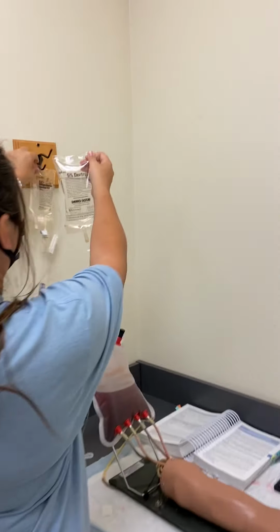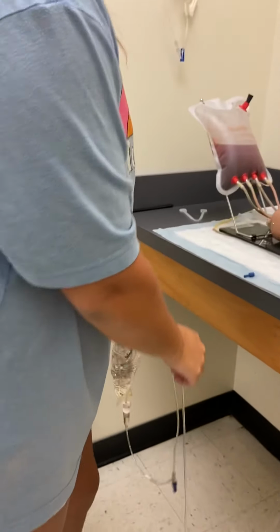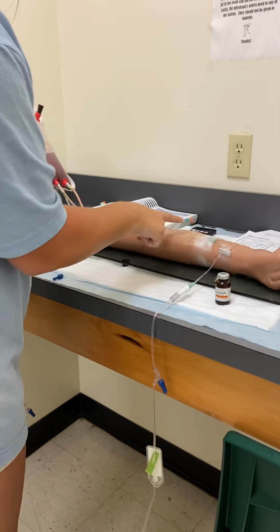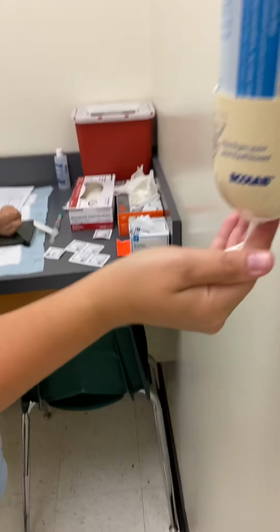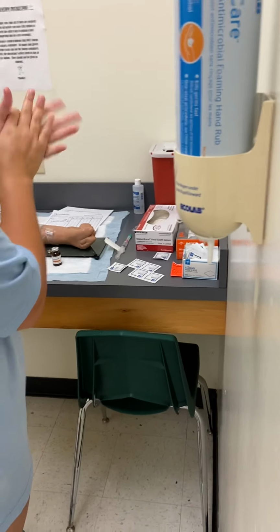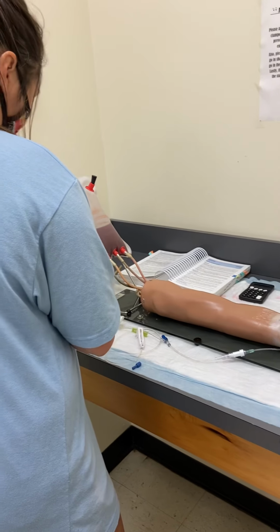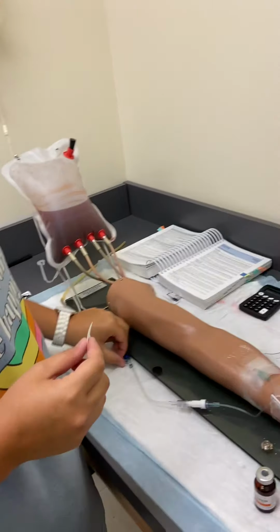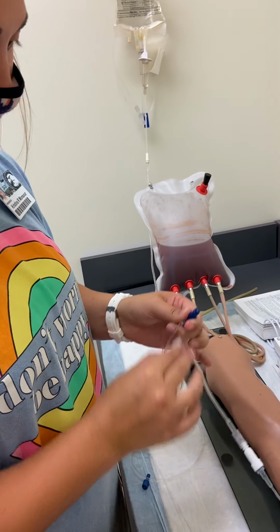I'm going to give the push first. So I would drop this and check for patency. I see blood return. There's no edema, no swelling, no infiltration. My push is compatible, so I do not have to clamp it off or anything like that. And wash my hands. And we'll be giving this in the port closest to the patient. Scrub that for 15 to 30 seconds. Let it dry.